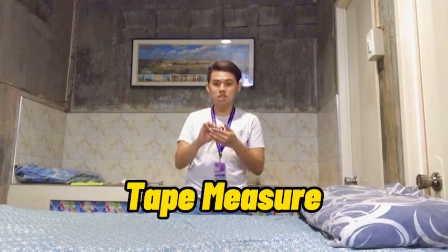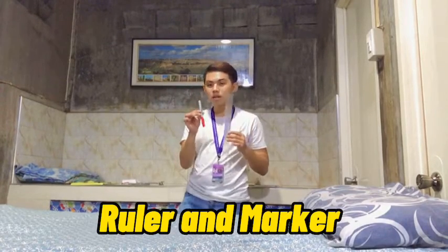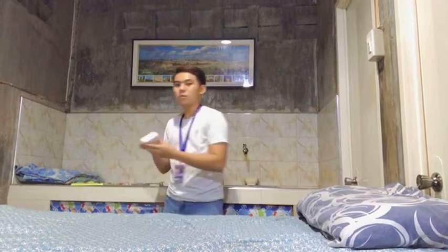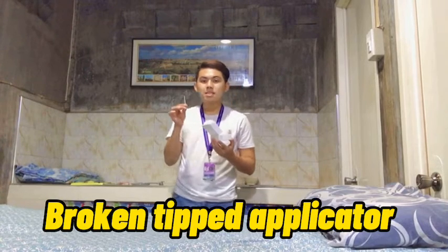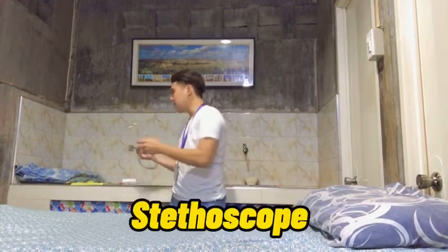So after verifying the need for performing the assessments, we will be preparing the necessary equipment for this assessment. And these materials are of course, number 1, tape measure. Next, we will be having a ruler and a marker. And of course, we should have a broken-tip applicator, this cotton applicator. For example, this is for testing hypersensitivity in the patients. The next one is, of course, we must have this stethoscope for the auscultation of the abdomen.